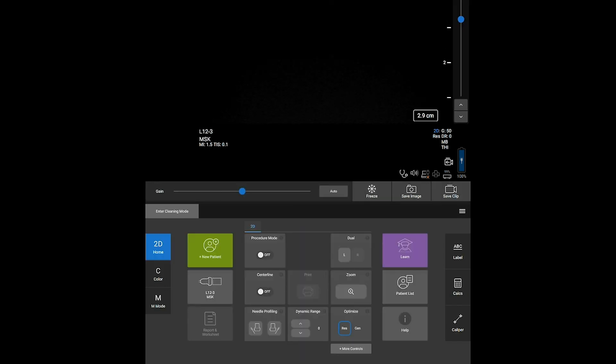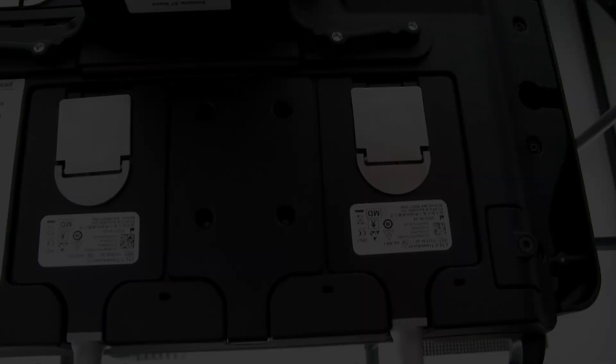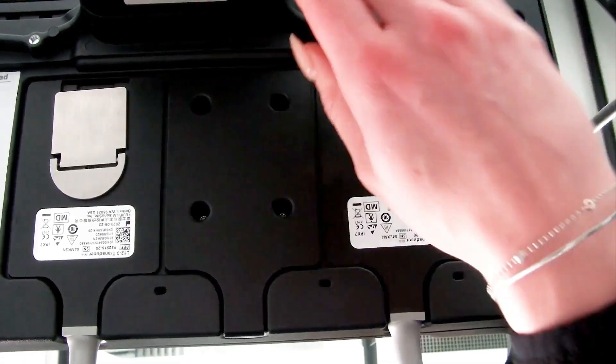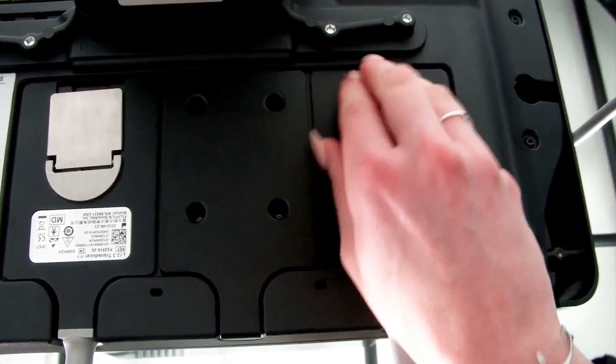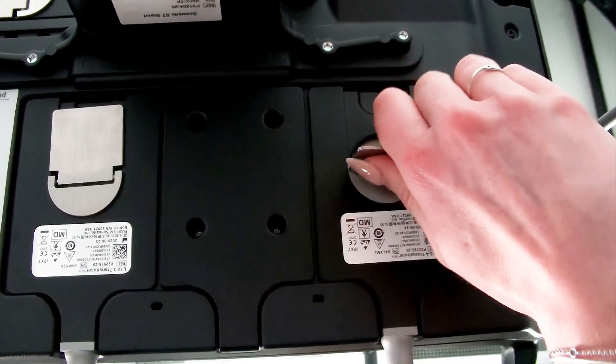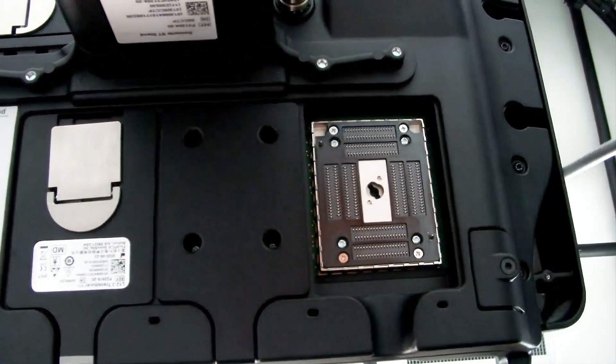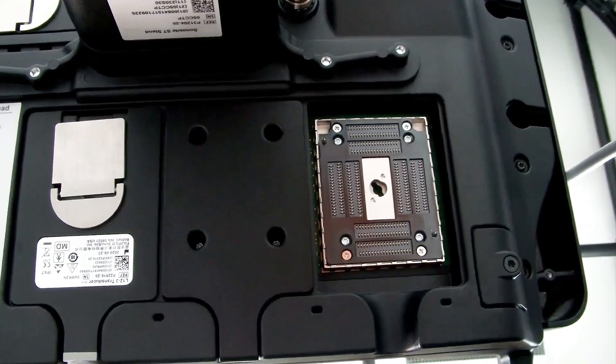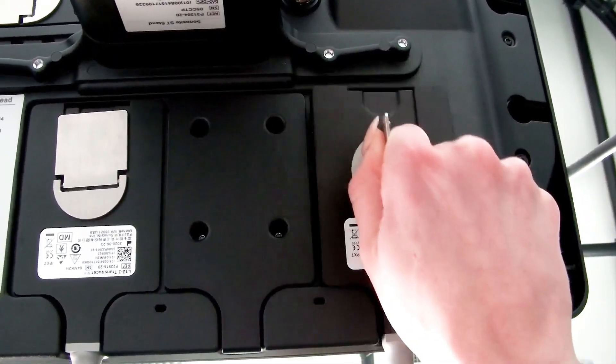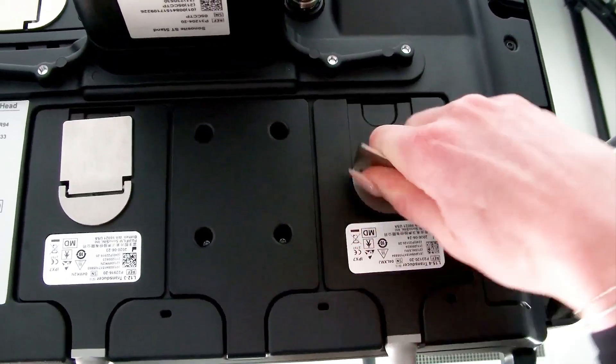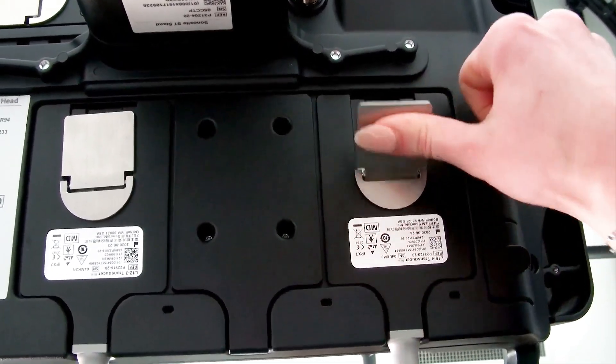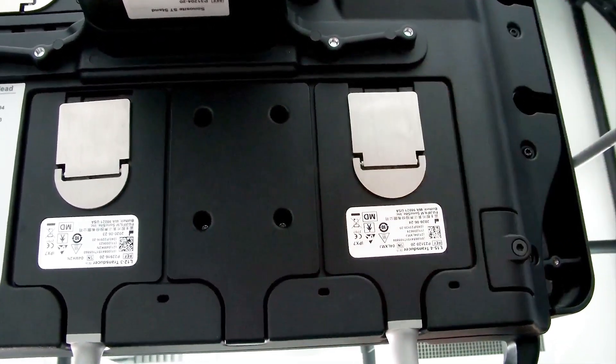Let's remove a transducer. Start by lifting up the latch on the transducer connector. Turn it 90 degrees clockwise and then pull the connector out. Reverse the process to connect the transducer.